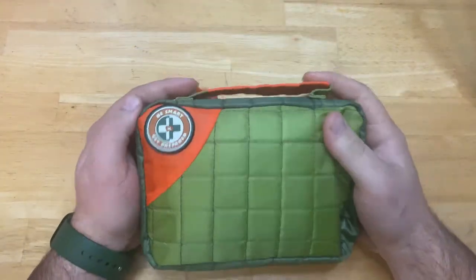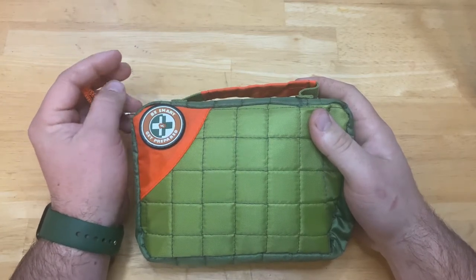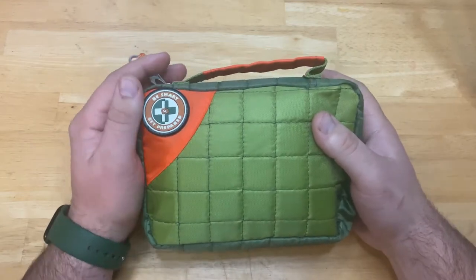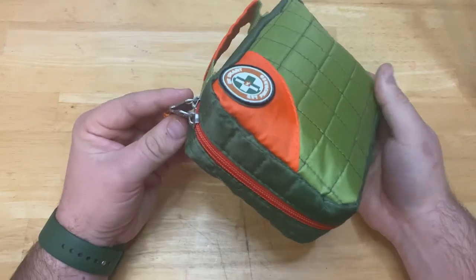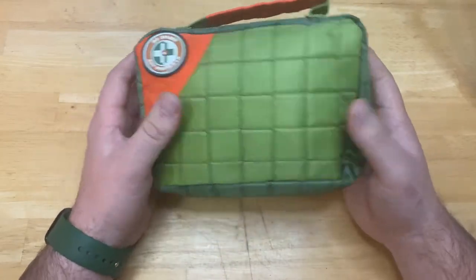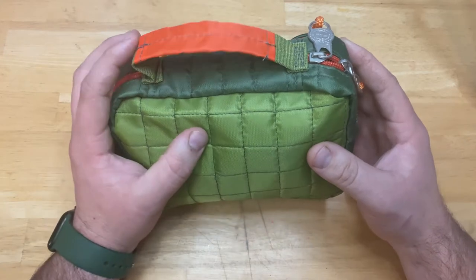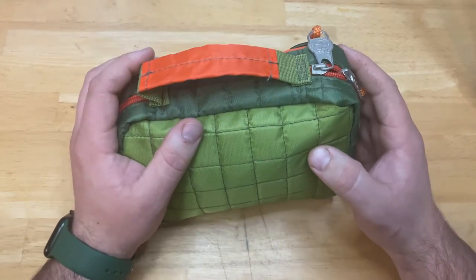What's up guys, it's Jeffrey back with another first aid kit review. This is the Happy Wonder Outdoor Kit by Be Smart Get Prepared. This is a 134-piece kit — quite a bit more than our other first aid kit, at about three or four times the cost. I think this was about $20; the other one was $5. I've had this one for maybe a month or so, it's been in my camper and we've never used it, so everything should be in here.